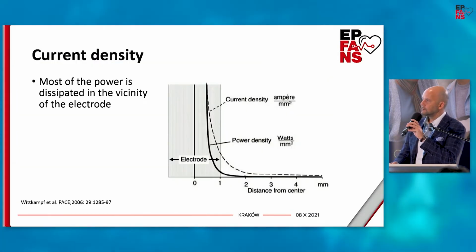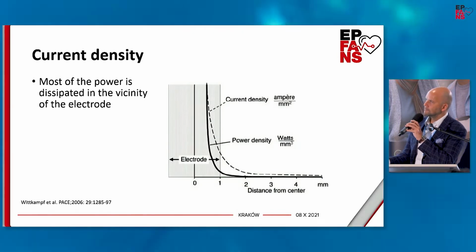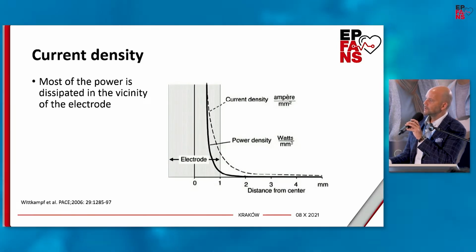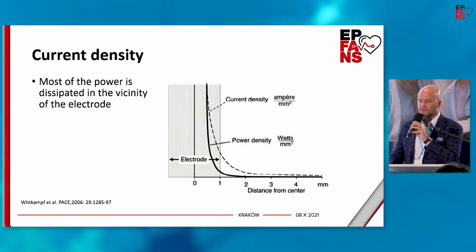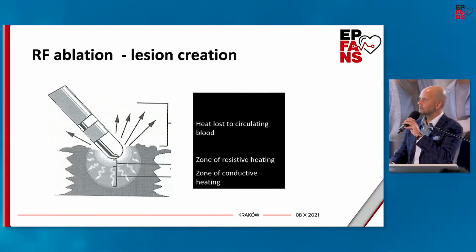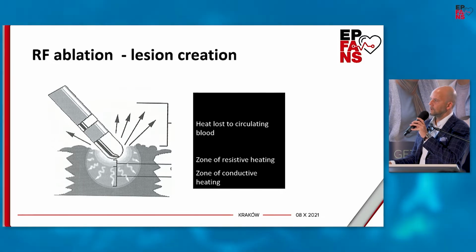Another slide explains the role of good catheter tip tissue contact. The current density decreases within few millimeters distance, and energy delivery becomes ineffective. That means that if we want to achieve durable lesion, we need to stay in a good contact with the tissue. Another important issue is that we need to influence the tissue with the current flow, not with the hot tip of the catheter.